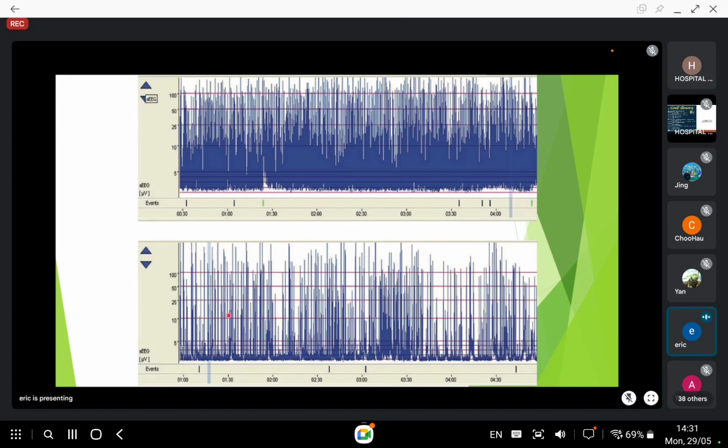So can we comment on, let's say, this one? Assuming that the impedance is good, this is two different waveforms. So assuming your impedance is good, where's the lower margin? This is the lower margin, right? Below 5. Okay. And then how about the upper margin? It's above 10. So it's discontinuous.